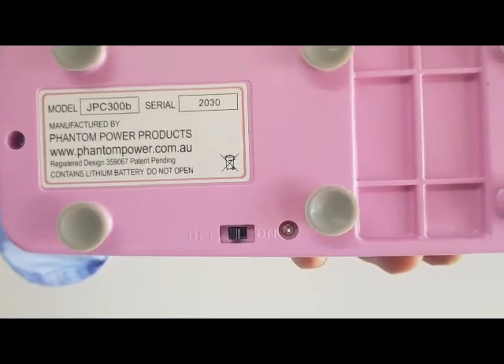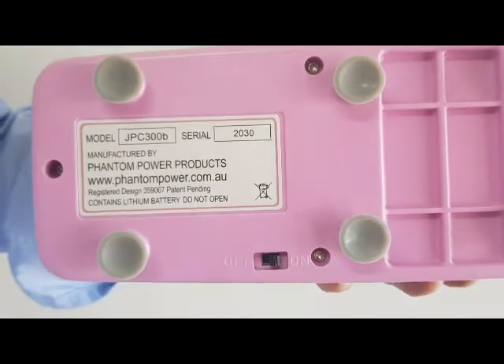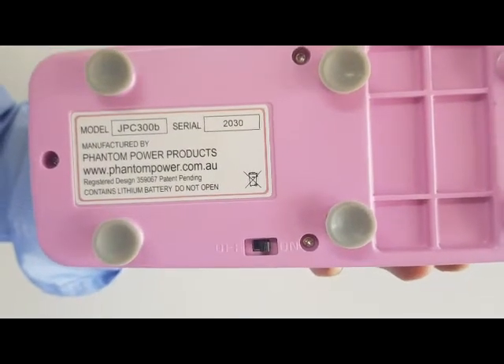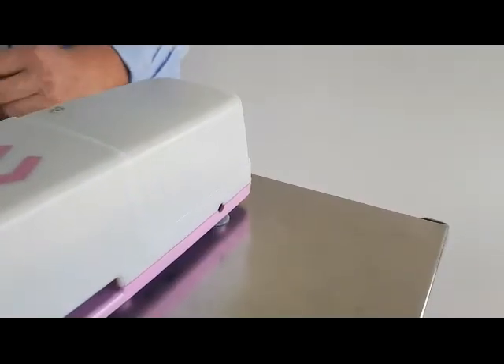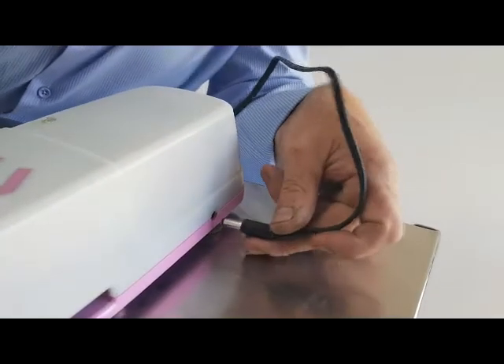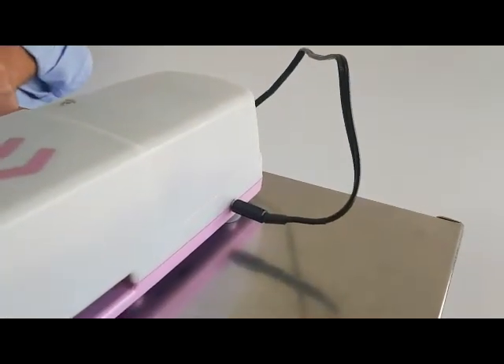On the underside of the Genie Pill Crusher you will find an on/off switch. Please make sure for charging the switch is turned on. For safe charging, please place the Genie Pill Crusher and the charger somewhere where it won't get disturbed, and then plug the charger into the Genie Pill Crusher.